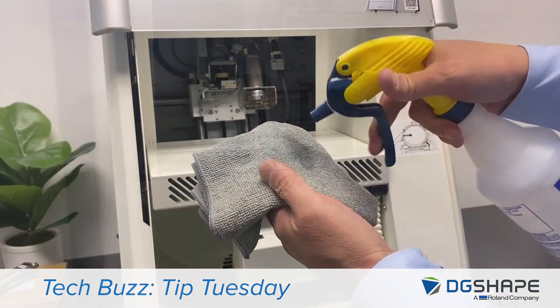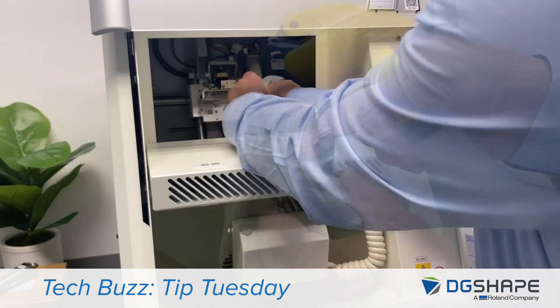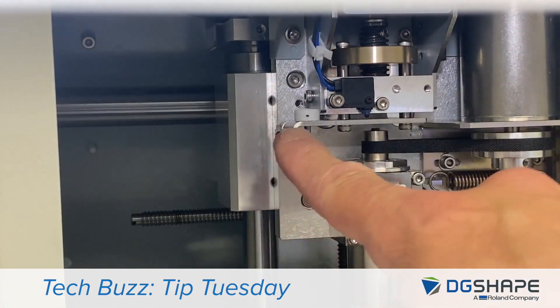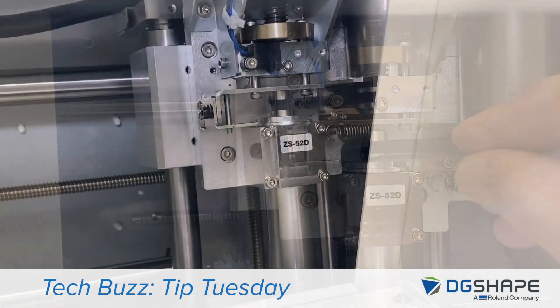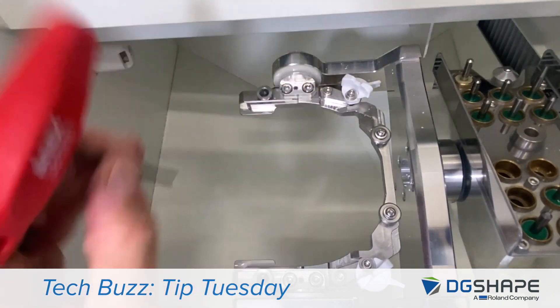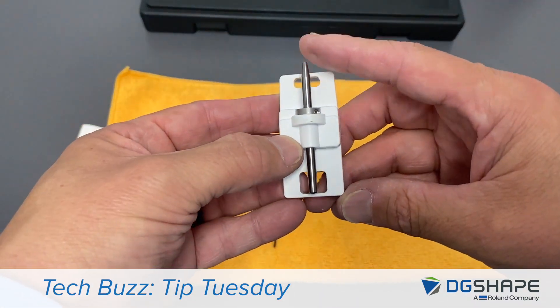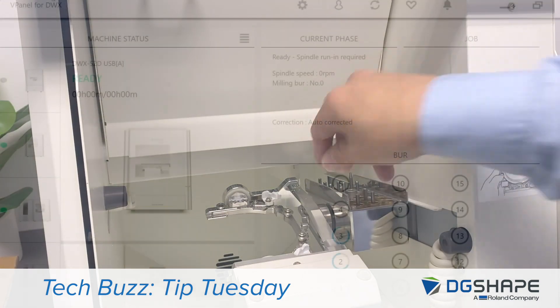Next, using some isopropyl alcohol, we're going to wipe down the entire assembly. Using a swab, we'll clean the conductivity plate and the spindle. We'll now check to ensure the spacing on the conductivity plate and the spindle is seated correctly. Let's check the screws on the C-clamp and the arm to ensure everything's tight. We'll inspect the lever and bearings, and look at the detection pin to make sure that it's seated in the correct position, in case you want to perform an automatic correction.